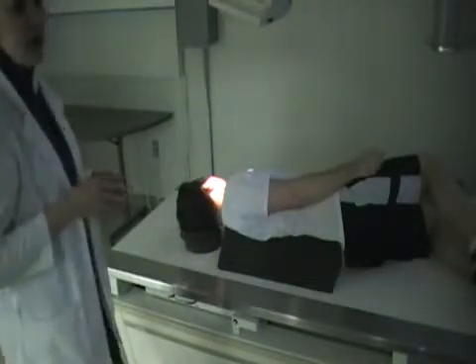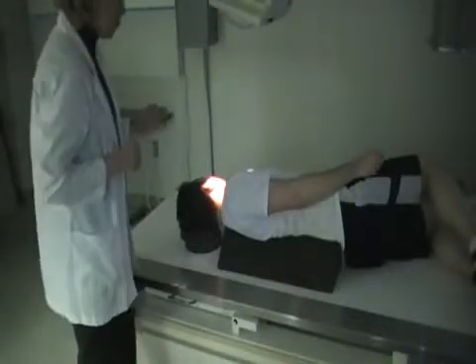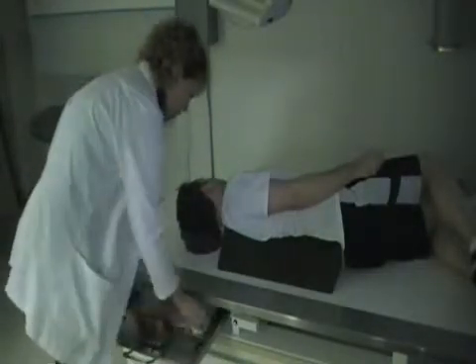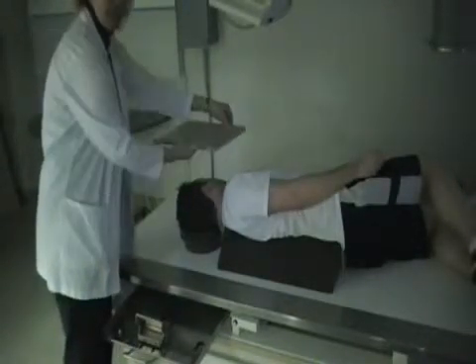Now, since we are doing the left oblique, we're going to place our left marker either on the left side here of the neck, or you'll have to pull out your image receptor, place your left marker here on the left side of the cassette, and put it in that way.